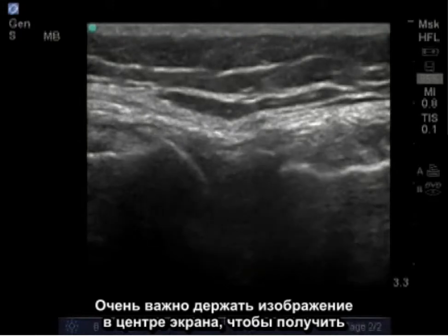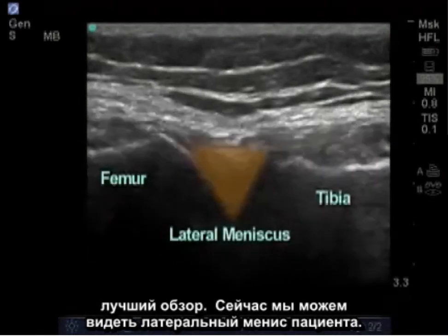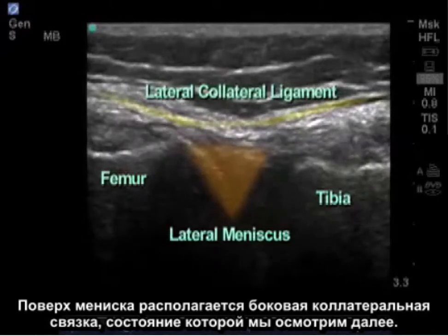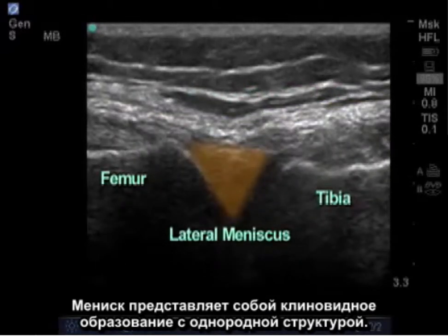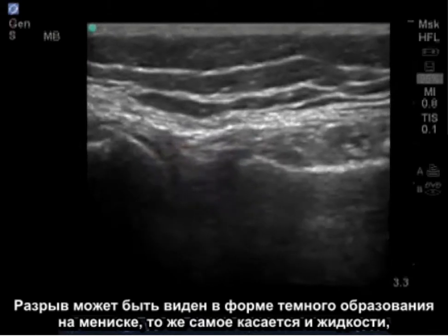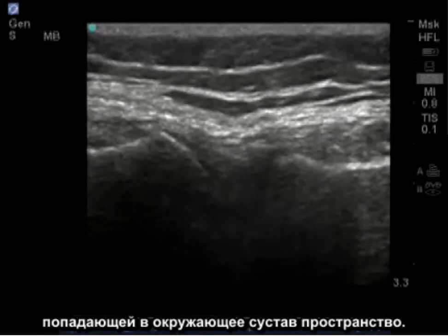It's important to keep your image at the center of the screen to get the best view. Here we can see the patient's lateral meniscus. Overlying the meniscus is the lateral collateral ligament, which we'll look at next. The meniscus appears as a wedge-shaped structure with a homogenous pattern throughout. A tear may show dark patterns within the meniscus, as well as fluid leaking into the surrounding joint space.